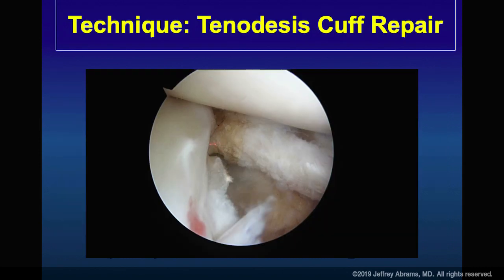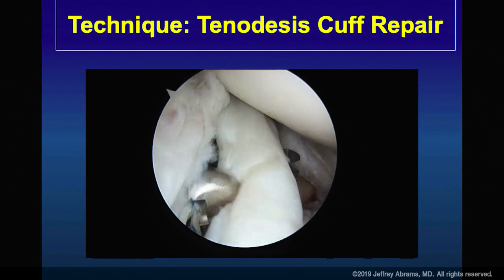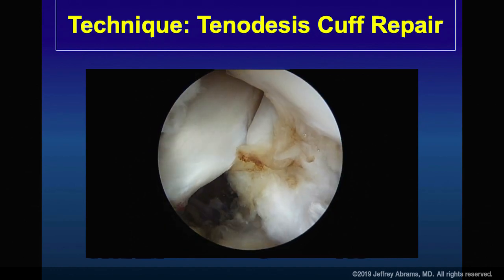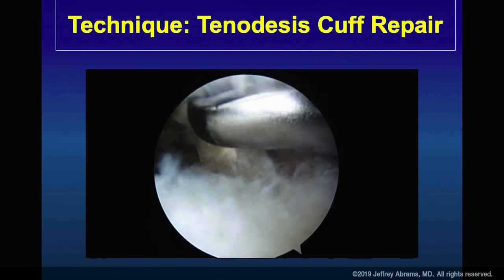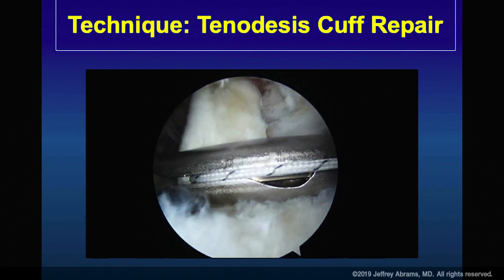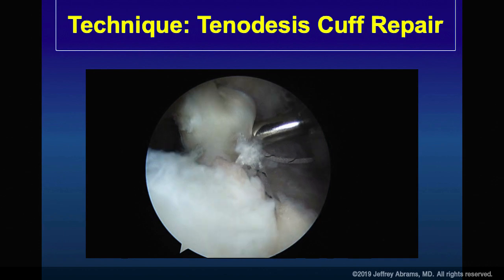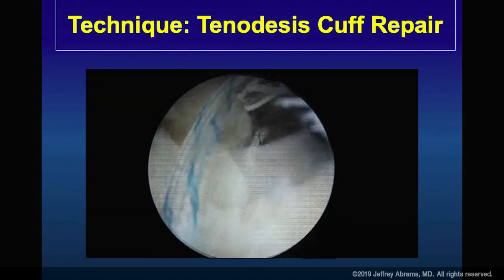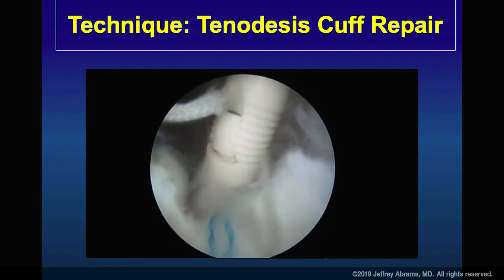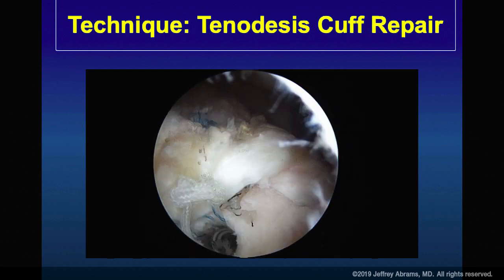Right shoulder, lateral decubitus — biceps to your left, subscap to your right. I'm on both sides of the biceps, putting a stitch through my anterior portal in front of the interval, lateral to the coracoacromial ligament. I use cautery to divide the biceps and bring it out — it pulls up on the subscap and the anterior margin of the supraspinatus. Now in the subacromial space from the posterior viewing portal, my third stitch from the anterior anchor goes through the biceps; the other two went through the supraspinatus — one mattress, one simple. I bring the biceps over the top, release the traction suture while tying, then take the free edge of the biceps and sew it into the infraspinatus, creating a capital-A shape. I take the last stitch to a knotless anchor, achieving tenodesis and coverage that bridges the defect.